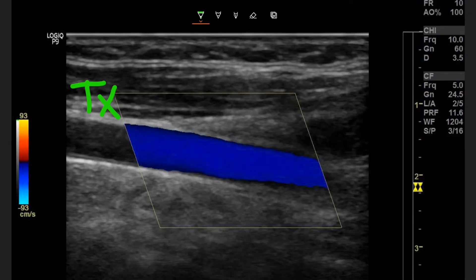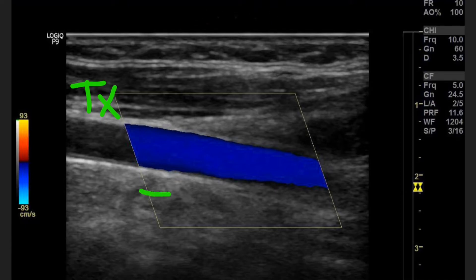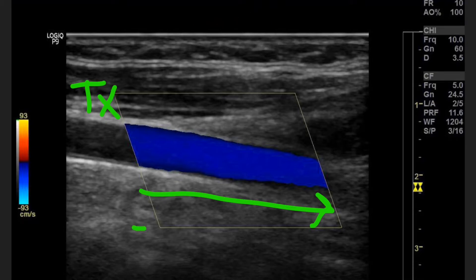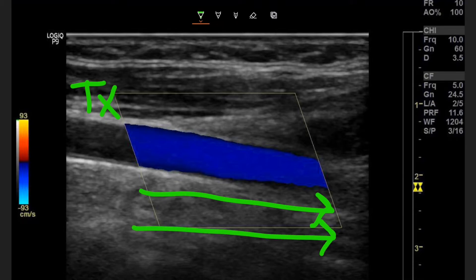For this next image, our transducer location is still over here on the left because we are still steered the same way — our box is steered the same way, so our transducer location is still the same. But now the color in our vessel is blue, and we know that blue is going away from the transducer, meaning that we're going from left to right.